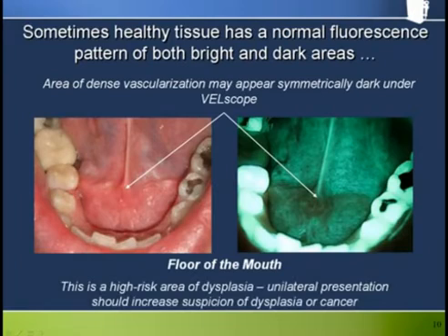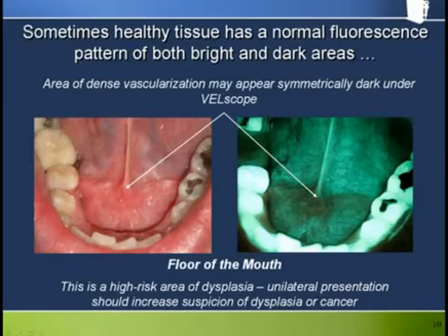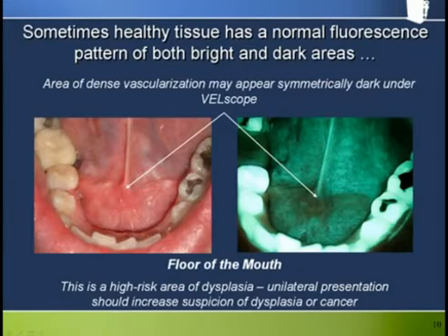This is a Velscope picture of the floor of the mouth and the corresponding area under white light illumination. The ventral surface of the tongue is also partially visible at the back. Again we see the theme of blood's role as a strong absorber in fluorescence visualisation. The area around the sublingual gland can be well vascularised and is particularly so in this example, showing up as a symmetrically dark area under Velscope.